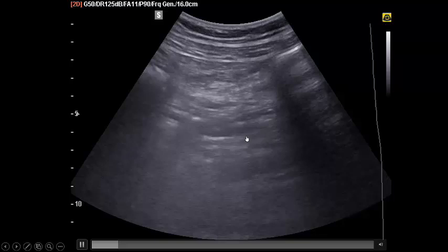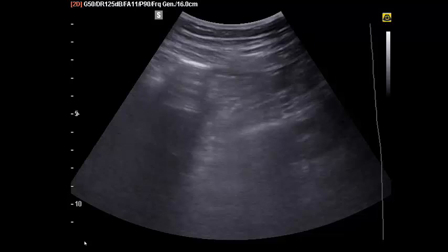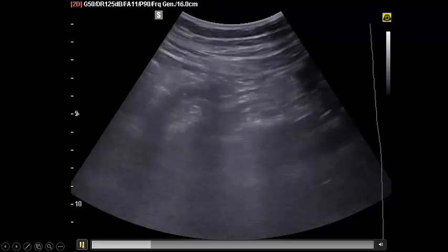Okay. Intestine is very important here, because if I have acute mesenteric ischemia, I will expect to see a very thick intestinal wall, and I will expect to see ileus and no peristalsis, and this is very important. Let us see the intestine of our patient.